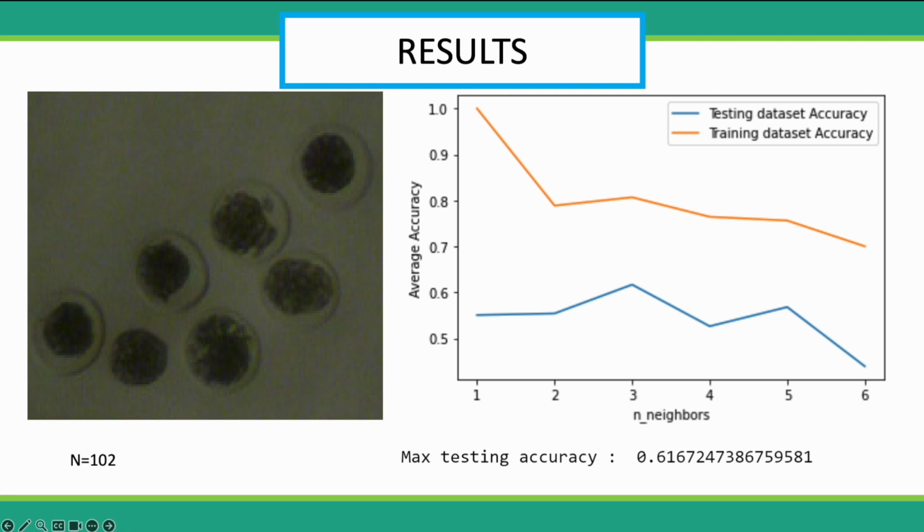We then used the k-nearest neighbors equation, which in our case compares the embryos with an unknown sex identity with embryo mean pixel change of known sex. We use the k-nearest neighbors equation to see how the value compares to the embryo values of the known sex. We found that if we take the three closest values, we were 61% accurate in predicting embryo sex.